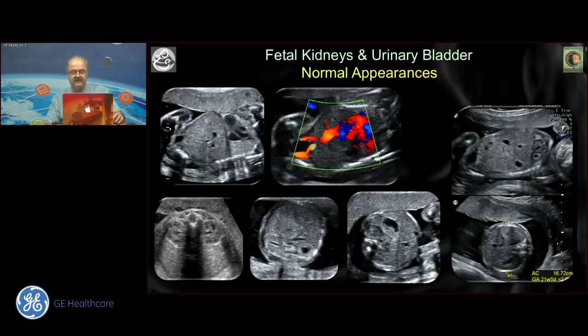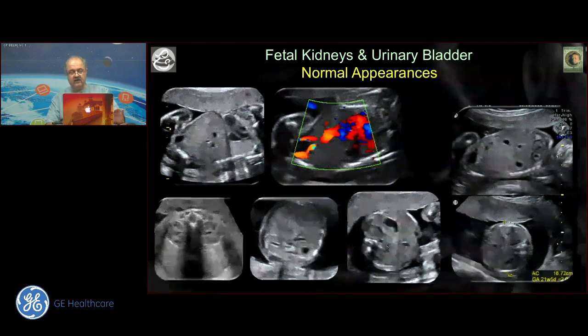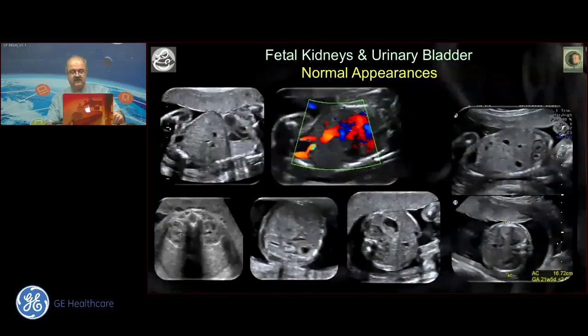B, the best section apart from the 12 o'clock spine would be a 6 o'clock spine. And since our abdominal circumference is done usually with the spine either in a 3 o'clock or a 9 o'clock position, this is not the best section to look for kidneys. For the kidneys, you always need a special section. And of course, the story doesn't end in just looking at it in the axial section. You have to look at it in longitudinal section as well.